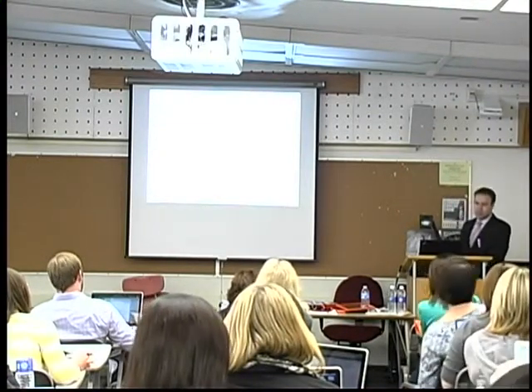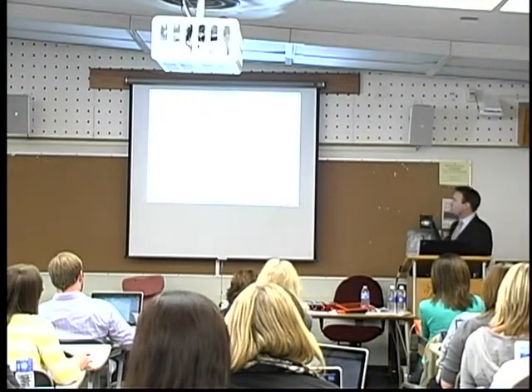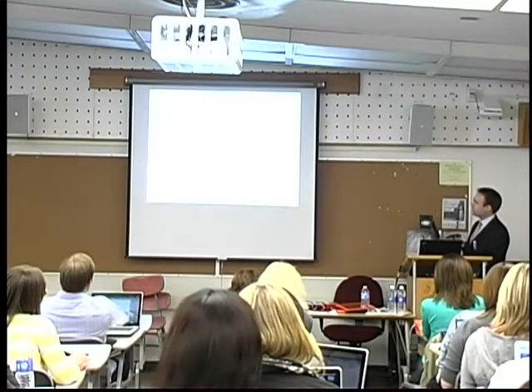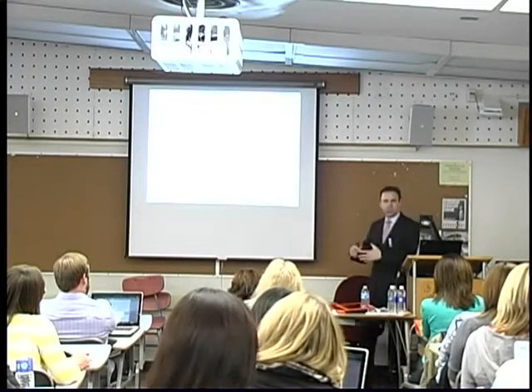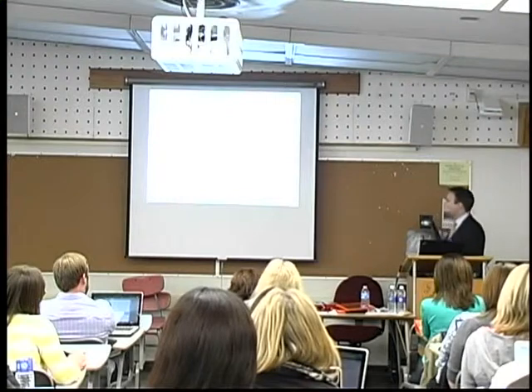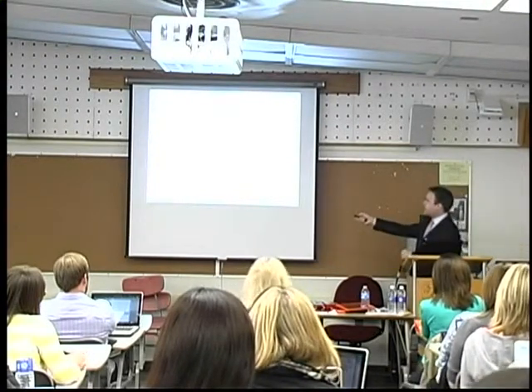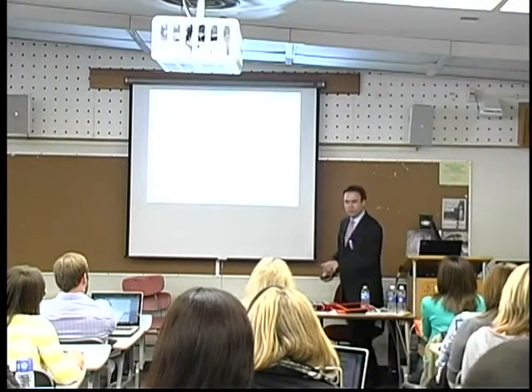Well, first of all, they allow us to compose more detailed messages, and they enable the user to communicate very precise requests, and that way they might prevent communication breakdown. It's easier to be understood; you're highly intelligible even to unfamiliar communication partners with a speech-generating device. Research has suggested there might be an advantage in having this additional speech model coming from the device.